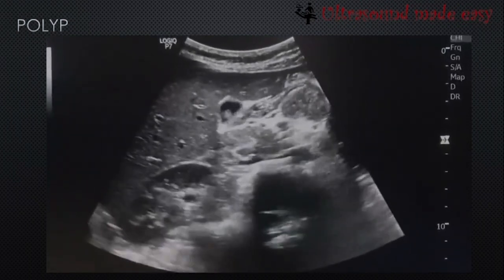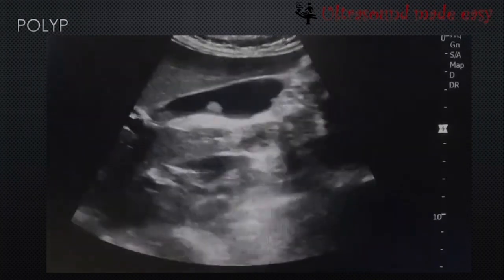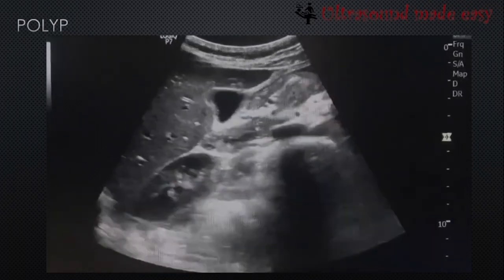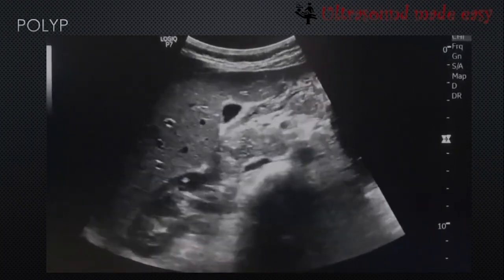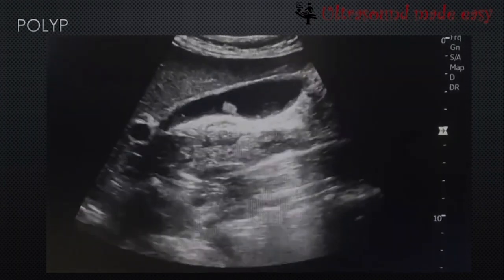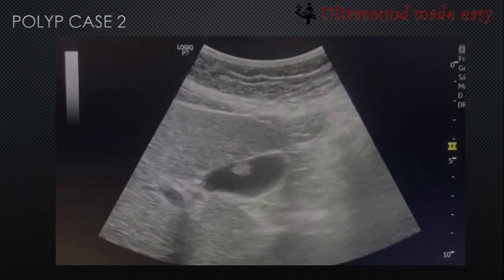Another important finding in case of polyp is that we have to look at the feeding vessels. In this case it is not shown here, but we have to look carefully at the feeding vessels. A polyp will definitely have a feeding vessel. If the feeding vessel is found, the diagnosis of polyp is confirmed. The case that you are seeing in the video is a case of gallbladder polyps. The feeding vessels, I am unable to make a video of that.